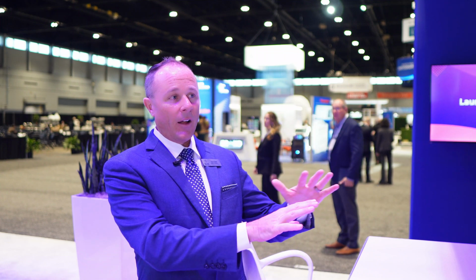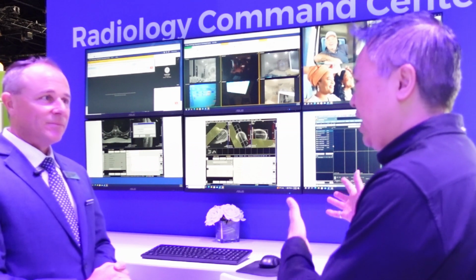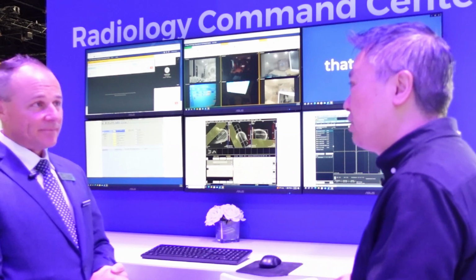And our technologists are so adept at doing this, and they're doing this every day and multitasking, they're actually operating 3 scanners simultaneously. So this network is a simple network, believe it or not. You'd think from an IT perspective, this infrastructure has to be crazy. No, it's a software KVM switch. Wow. And so what you're able to do is really help the organization scale. They don't have to have someone local. They can be remote. They're monitoring three different units at the same time, perhaps at 3 different sites.